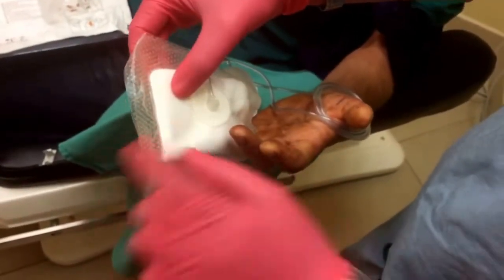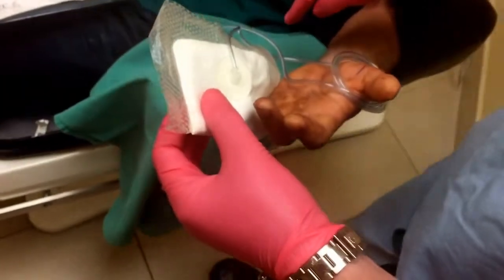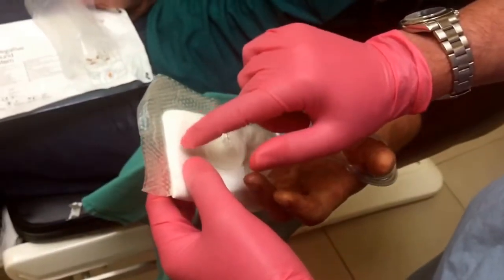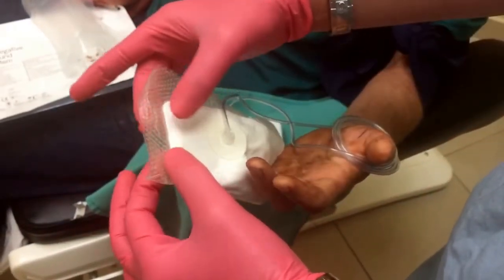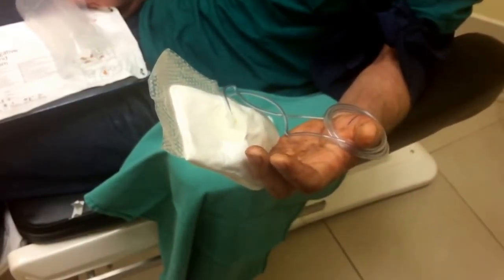And now you can literally see it — it's getting hard. And that is when it's hard. So you can see, if you touch it, it's actually hard compared to where it was before. That occasional vibration is normal.